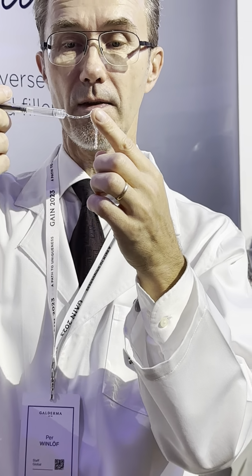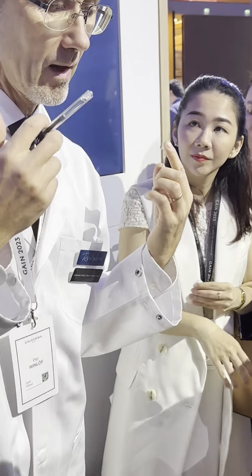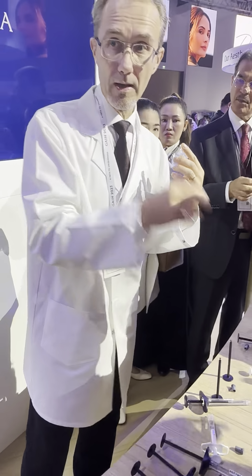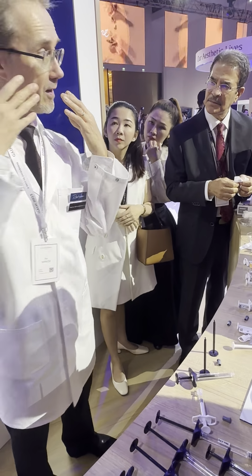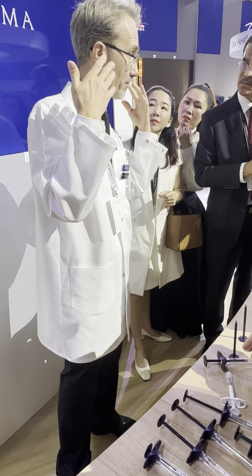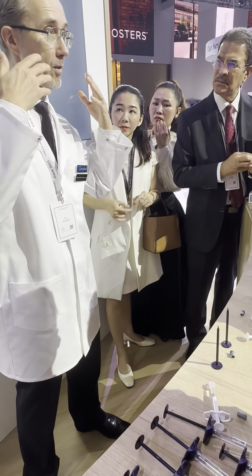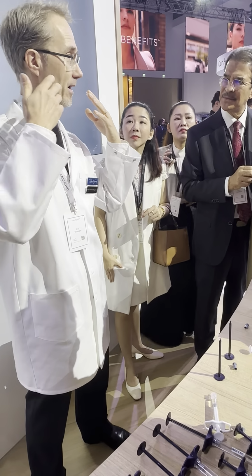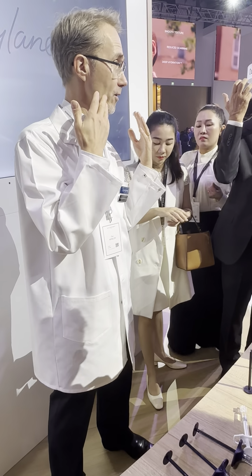And the fantastic thing about the flexibility is that if you treat a patient with a superficial treatment, or a patient with thin skin, what you don't want is that when the patient is smiling, the implant becomes visible in the skin.